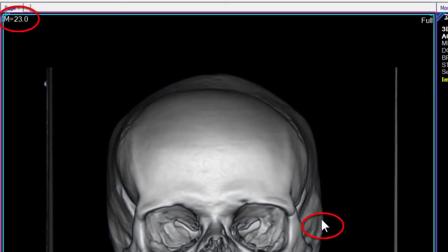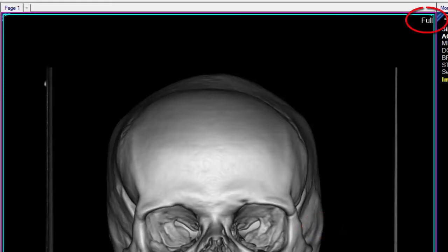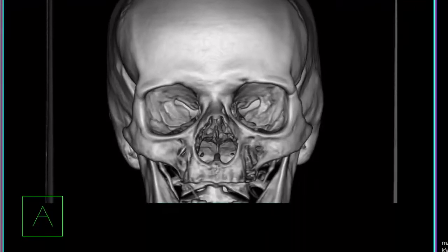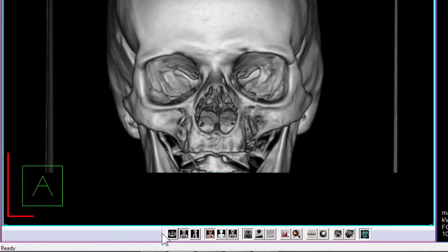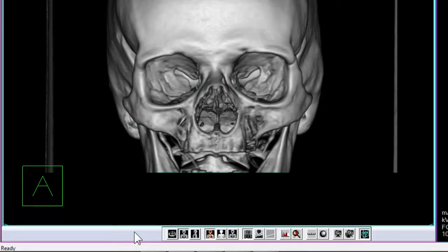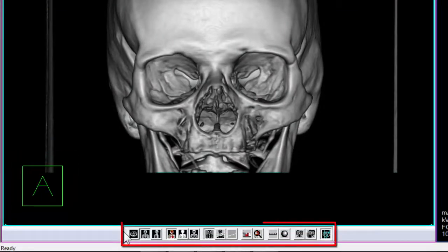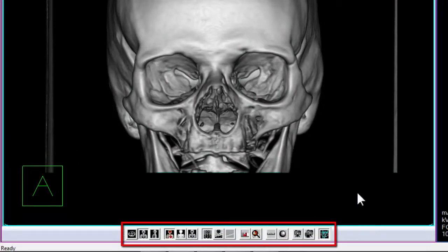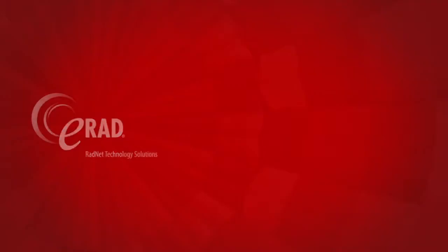Pixel value is displayed in the top left corner and correlates to the cursor placement. The applied reconstruction mode is displayed in the top right corner. An orientation cube will always be displayed in the bottom left corner of the frame. The plug-in's toolbar is located at the bottom of the frame by default, but it can be undocked and relocated.